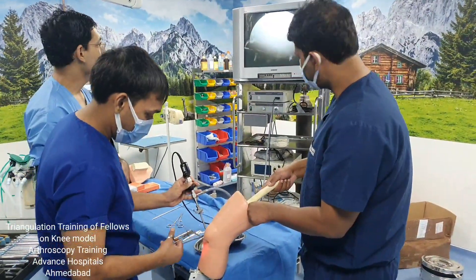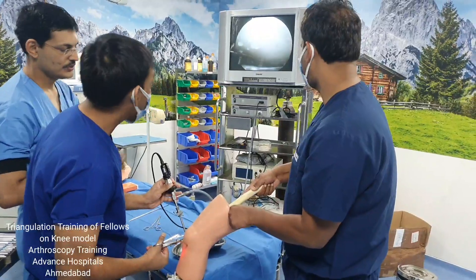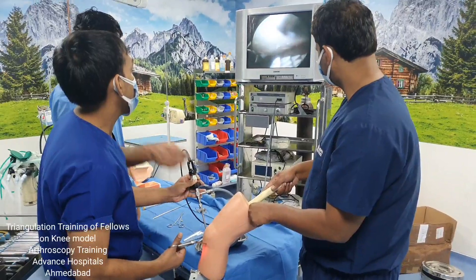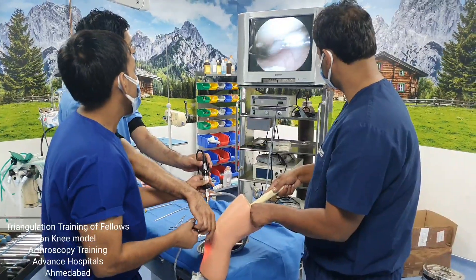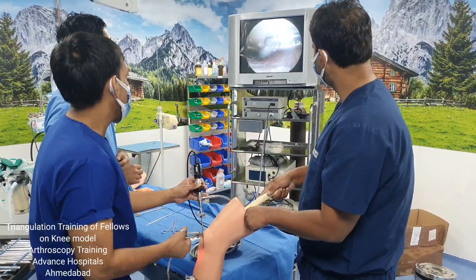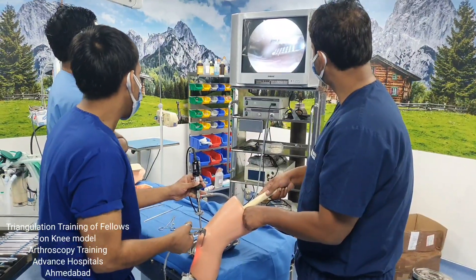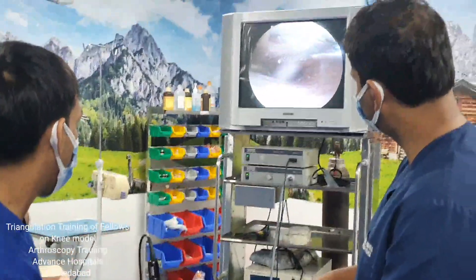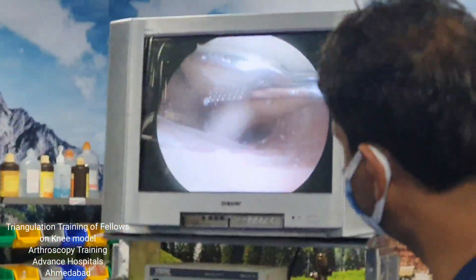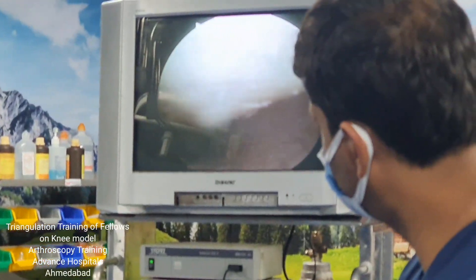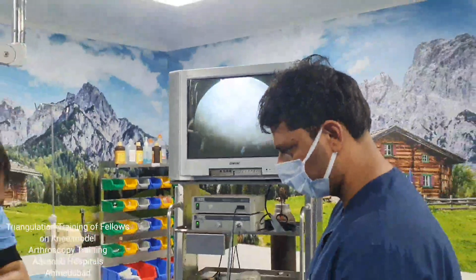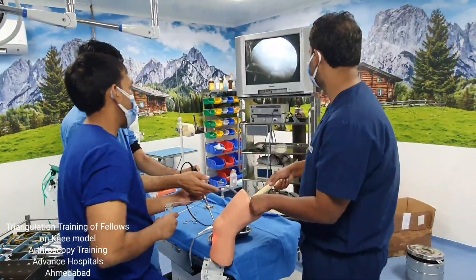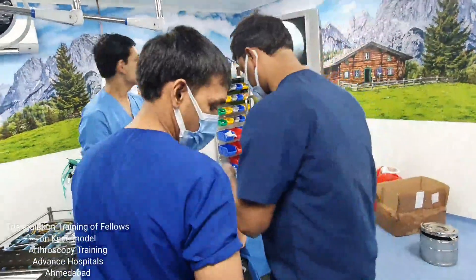We will be moving on with other procedures. Now you have seen how it is done — focus on the tip of the instrumentation, keep it a little bit apart from your side, and then with the grasper grab that loose body. Another small loose body has been removed successfully. Dr. Abhishek, you can also get your practice now — you can swap positions.